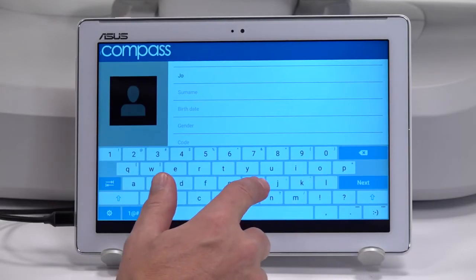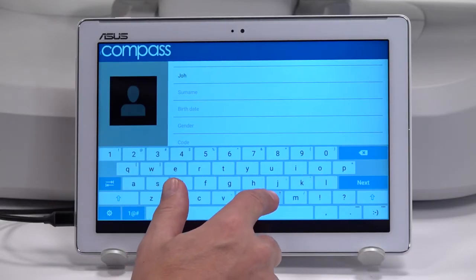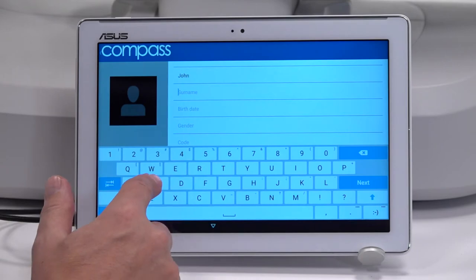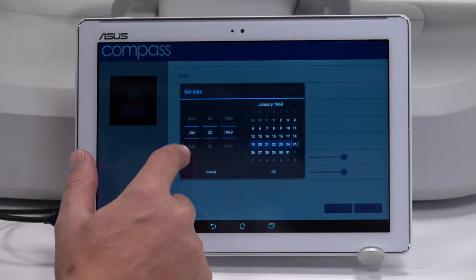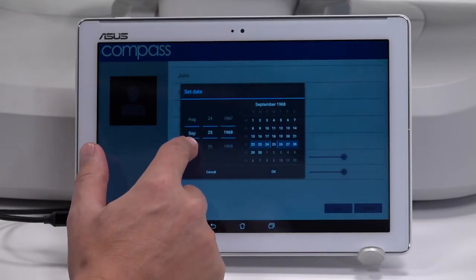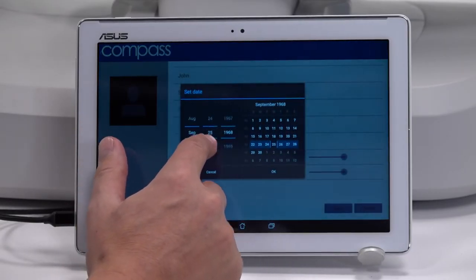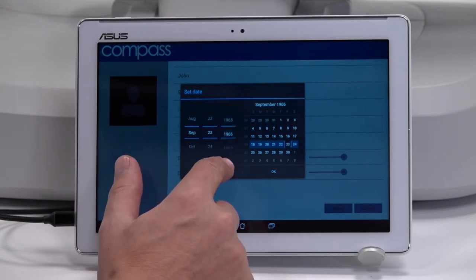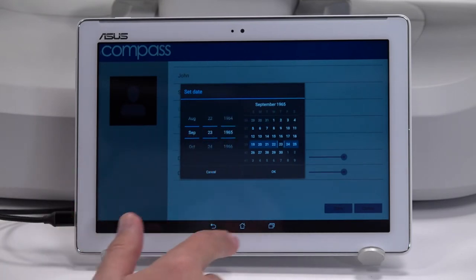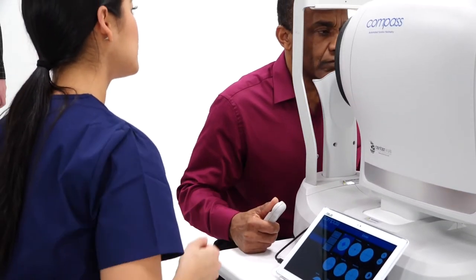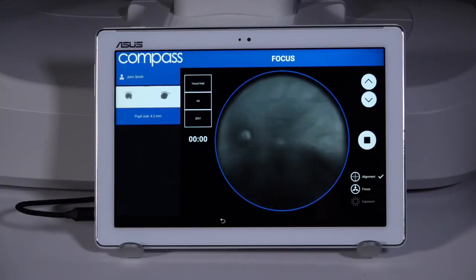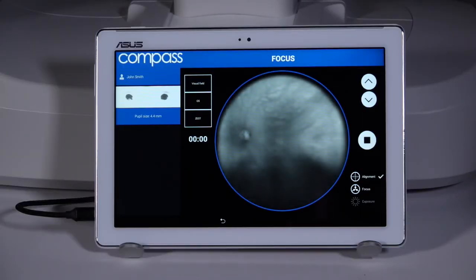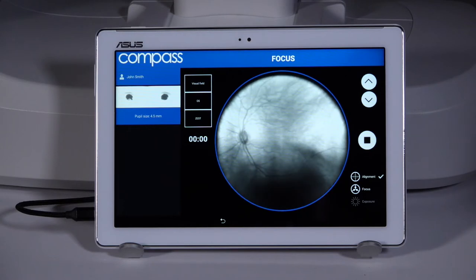Given name, surname, and date of birth are required fields. The compass will compare results to normative data from patients of the same age. It is not necessary to enter refraction data or use a trial lens due to the autofocusing and the projection system of the compass.